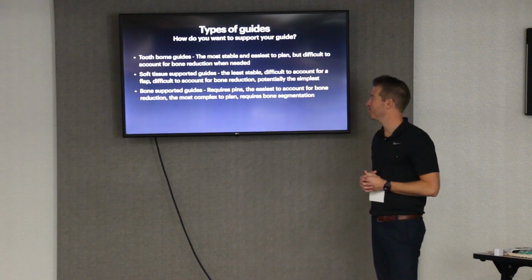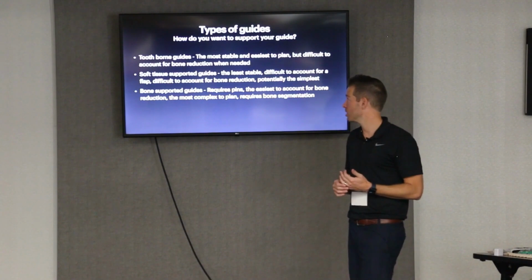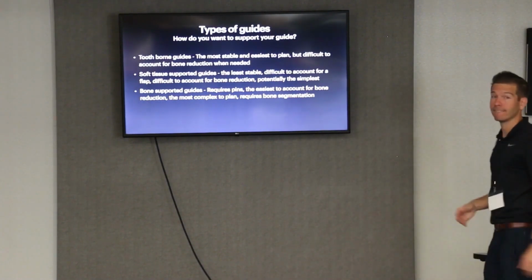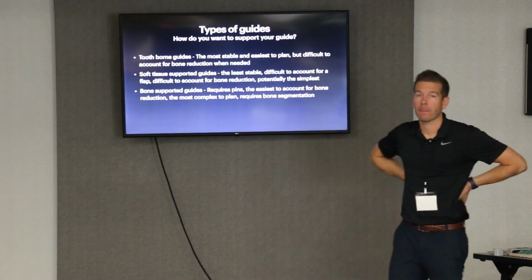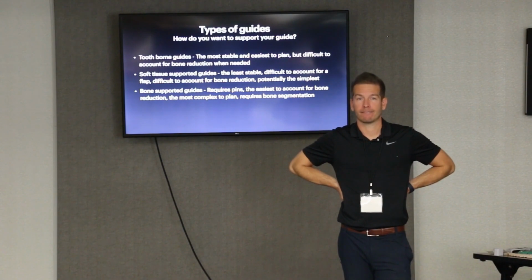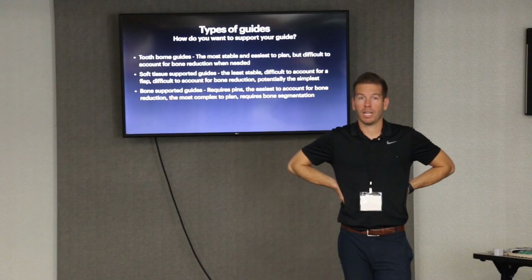But a lot of these patients have teeth. They have hopeless dentition. It's going to be more common. Bone-supported guides. Yeah, please. So you were talking about patients having more advanced perio. I would just guess that canines typically will have enough bone to support the guide. Do you ever run into problems with second or first molars where there are mobility issues, and so your guide, is it still better even if it's moving a little bit than the soft tissue guide?